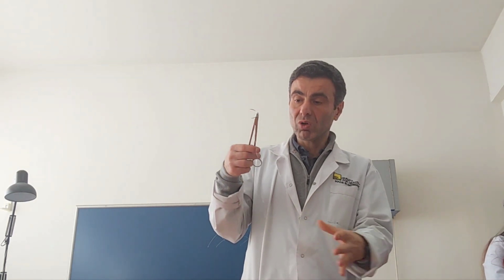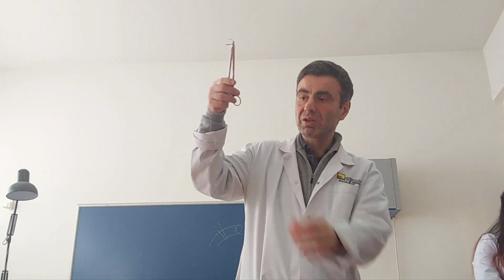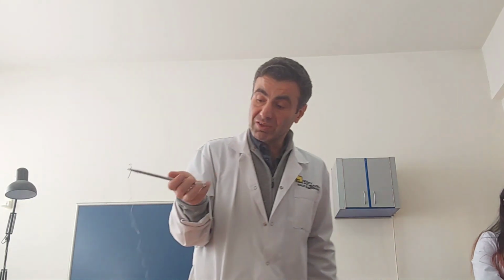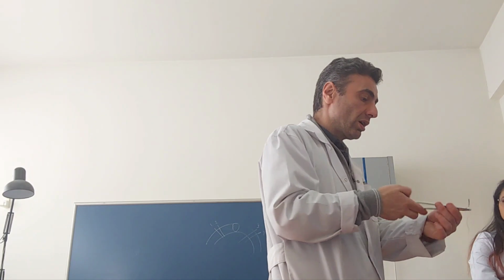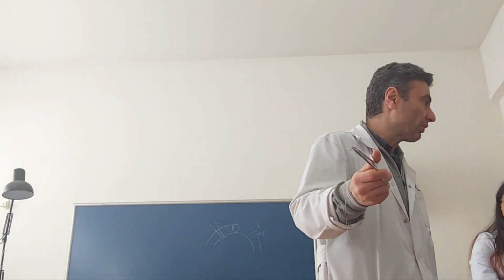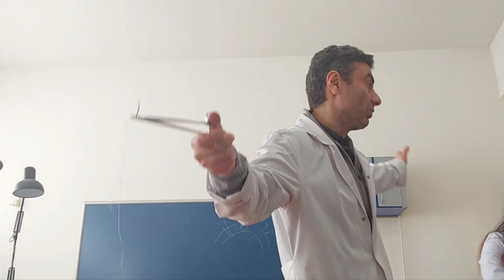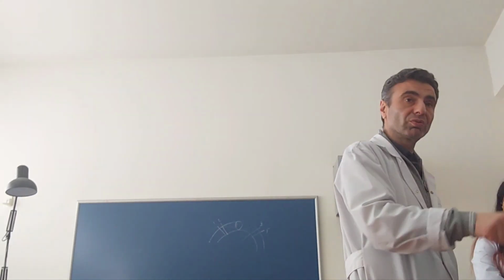So now I can work. I put the thread in such a position: the short side is 1/3, the long side is approximately 2/3 of the length. I must strongly close the lock of my needle holder. It is forbidden to work with an open needle holder because accidentally you can lose your needle inside of the tissues and it will be a big problem. That's how you close it. And in this position, you start to work to make a suture.